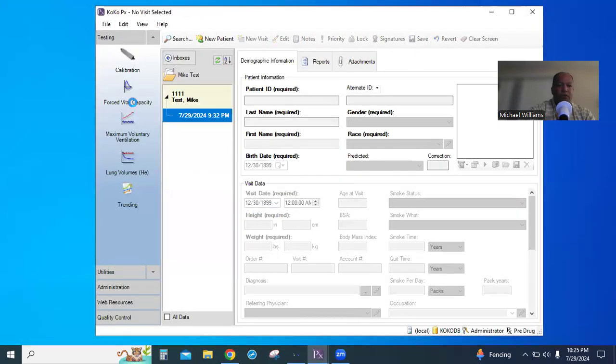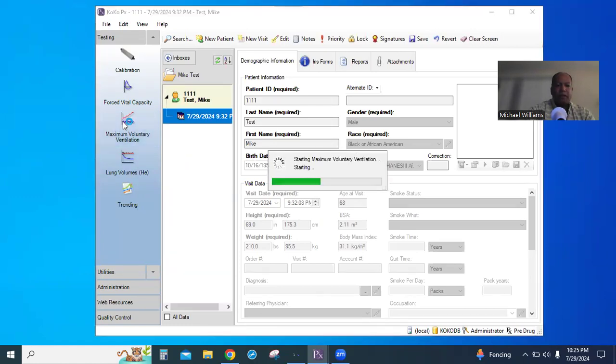So now we're going to do an MVV test. We're going to click on here, maximum voluntary ventilation. In this test, you put your mouth on here and you're going to go deep and fast for 12 seconds.